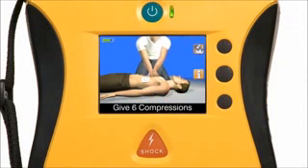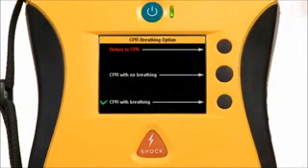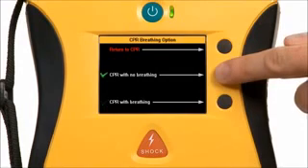And since not all rescuers are the same, there's real-time protocol selection. So, if you're a trained user who knows how to do both compression and rescue breathing, no problem. Just switch over to doing both without missing a beat. If you're uncomfortable with rescue breathing, then simply choose compression-only CPR.